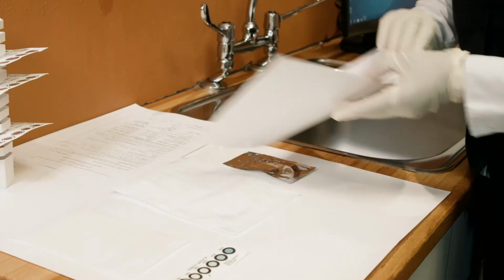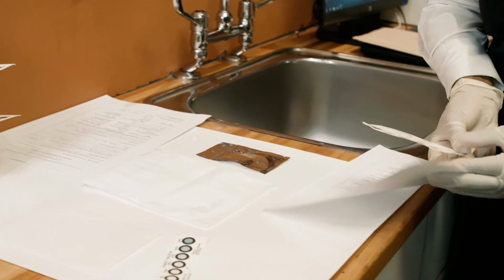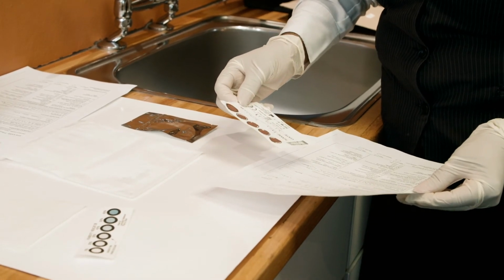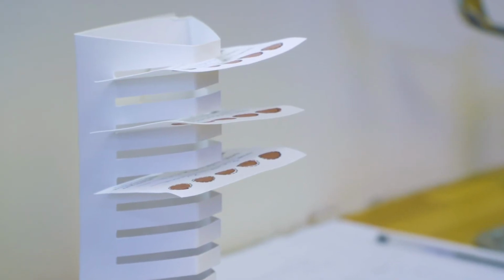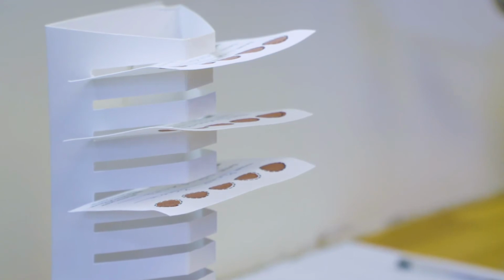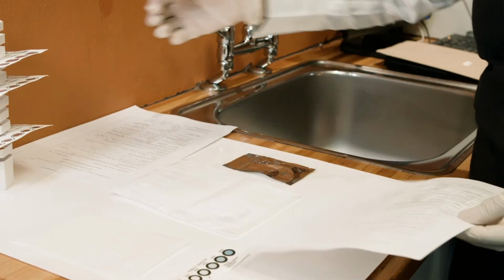Also, remember to keep the lab forms with the DBS cards. If you also collect DBS samples for early infant diagnosis, or EID, make sure to not dry VL samples and EID samples on the same rack. Putting both DBS types on the same rack can lead to contamination and potentially false positive results. Label each rack as VL or EID.